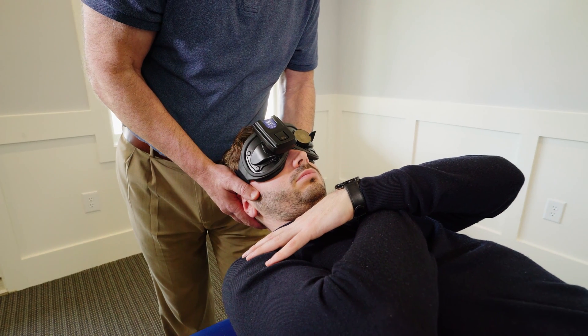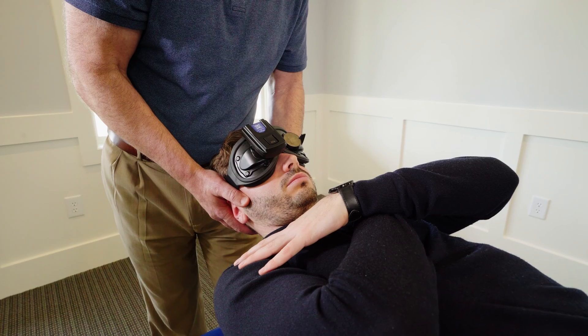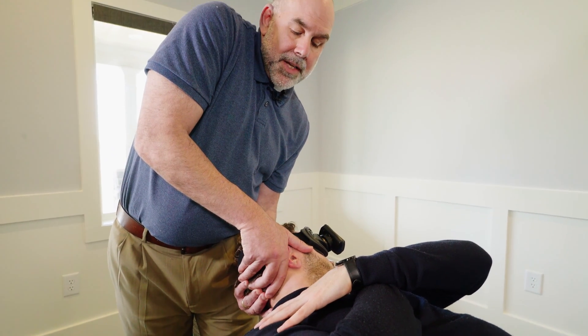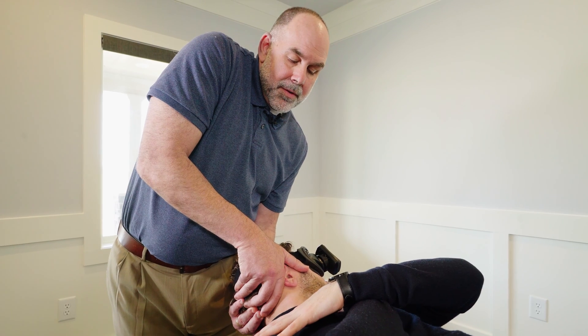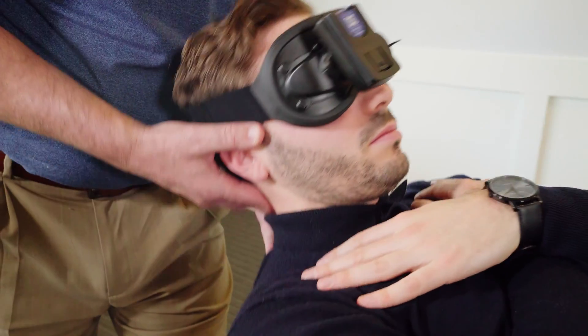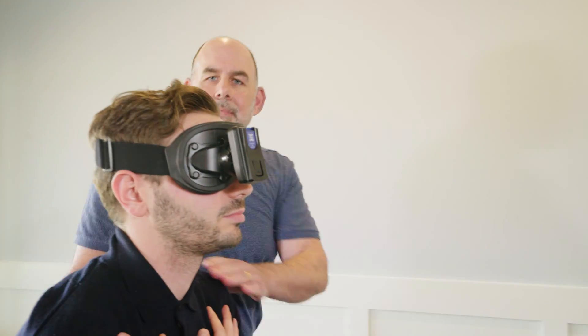You return to neutral. Again remaining in the 30 degree pitch, you rotate to test the opposite side. And that's how easy it is to perform testing using the wireless video Frenzel system. Next, we're going to show you how you can monitor your patient using the system during treatment.